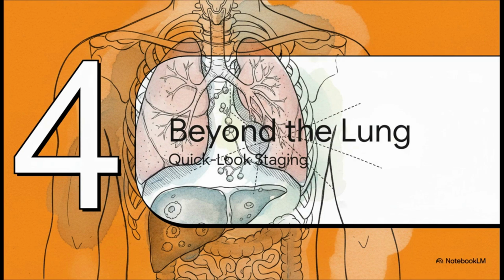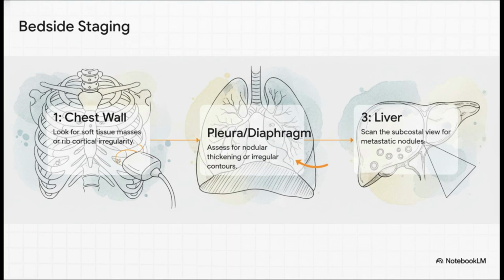But we don't have to stop just at the lesion. One of the best things about ultrasound is that we can easily expand our view and do some rapid bedside staging for local invasion or even distant mets. This can be incredibly valuable information. Let's see how. Here's a super simple but really high-yield checklist.